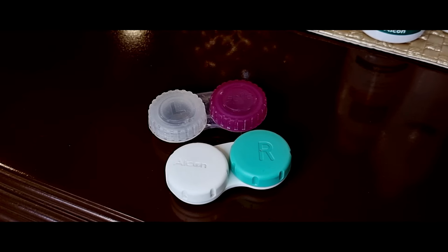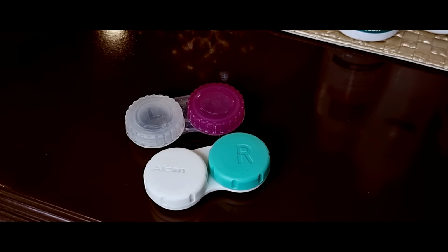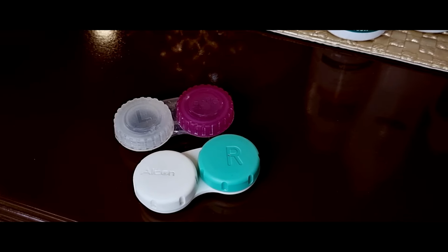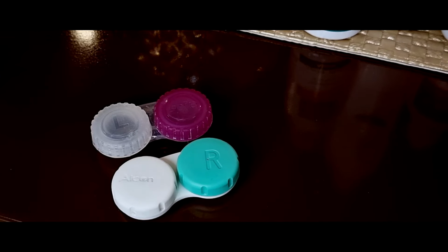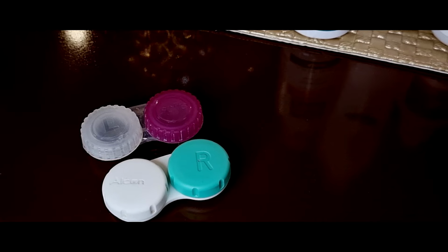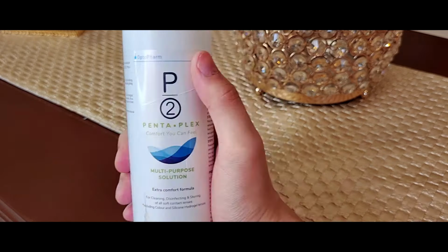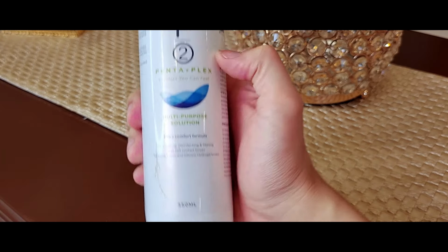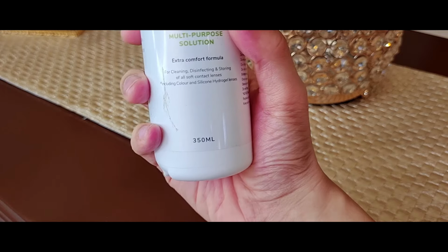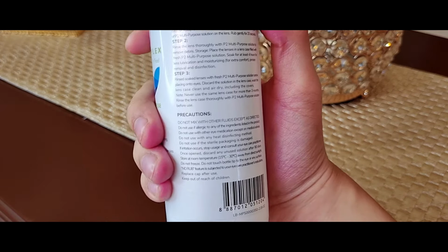The first thing I want to talk about is buying a cheap solution. This is something which I also did some time ago. When I bought my contact lenses new, I bought the best solution out there for like 2, 3, 4 months. But after that, I started searching for cheap solution, and I bought this Chinese solution which was really cheap. They also offered a case inside the box. So after using that cheap solution for almost 1 month, my eyes were really dried out, and also I was having blurred vision problem.